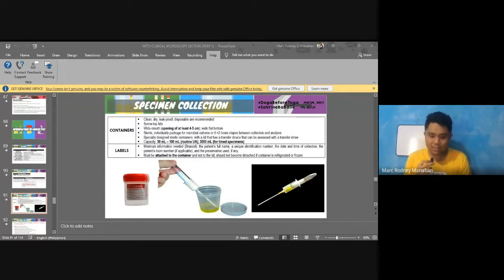Okay? Because in a way, for urinalysis, wala man after yun kayo sa bacteria, because what we're looking after is the chemical parameters and the microscopic findings. Although apil ang bacteria dito, pero in terms of identity of the bacteria and the characteristics niya, hindi na siya labot sa urinalysis. It's in the microbiology section. So if ikaw CM intern ka, kadawat ka og specimen na na-requests for both urinalysis and culture, ihatag sa microbiology ang urine dito. Okay, kaya culture una. And then ihatag sa medtech dito na, ma'am, pakibalik lang ang specimen after of process, kaya ako siyang i-process for urinalysis.